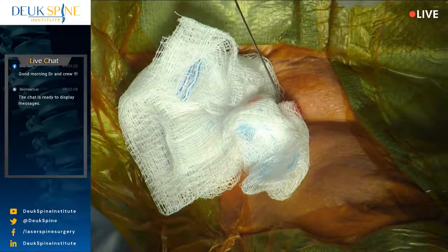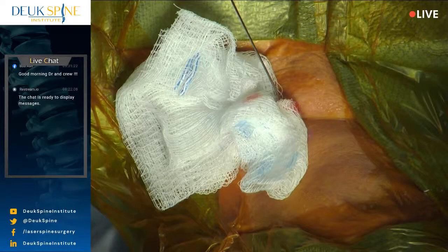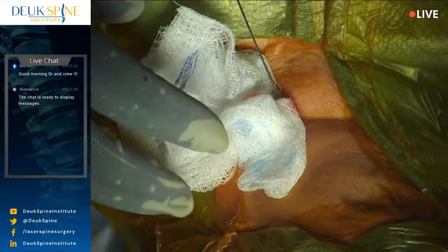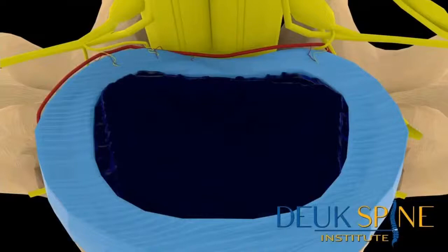All right, Zach, why don't you run a video for our audience to show them how a herniated disc can cause neck pain and arm symptoms. Meanwhile, we're going to place our dilator. Are you running the video? It's running now. Good.